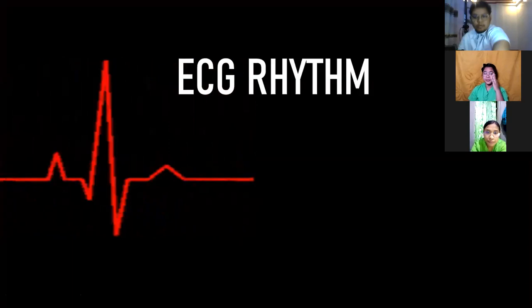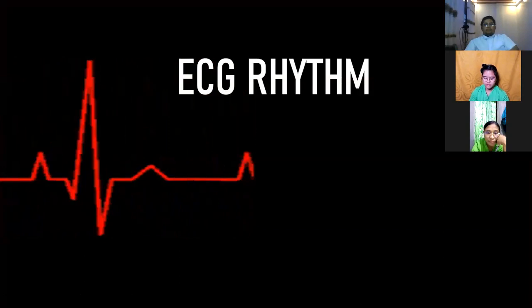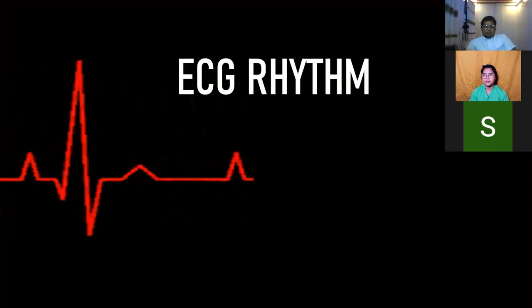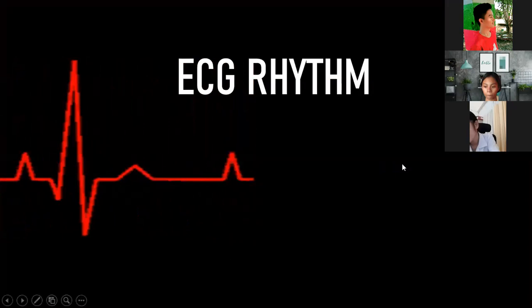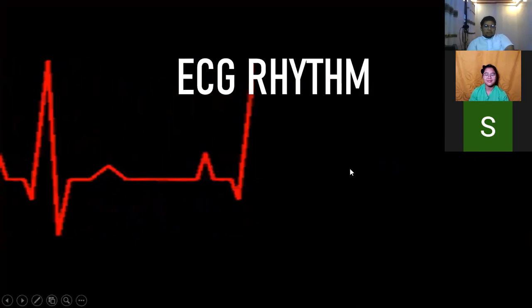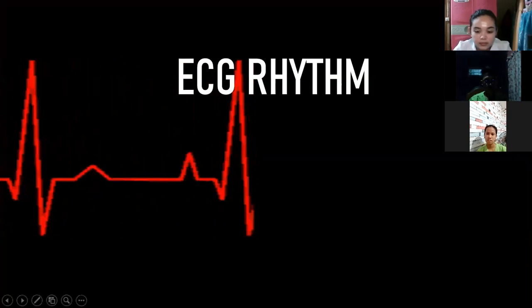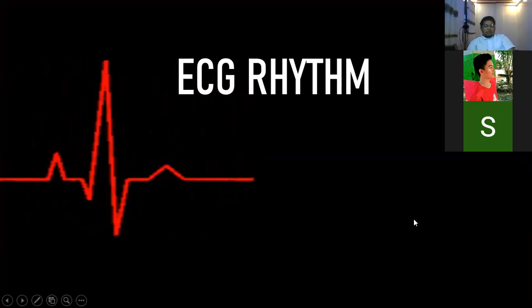Magpapakita lang ako ng tatlong rhythm para mas ma-appreciate nyo yung ECG rhythm. Kasi meron dito normal, bradycardia, and tachycardia. So, familiar naman kayo sa bradycardia, di ba? Kasi nasa funda nyo yan. Ano ang bradycardia? Lower than the normal heart rate, ma'am. Yes. Then, di ba yung opposite niya is yung tachycardia? Yung bilis ng pintig. Tachycardia yun, ha?